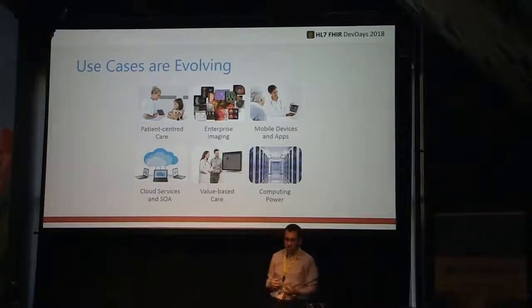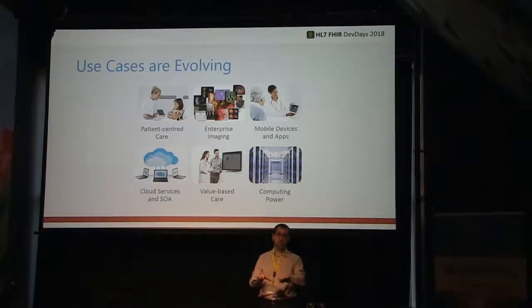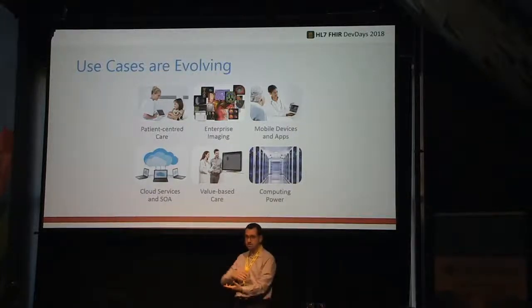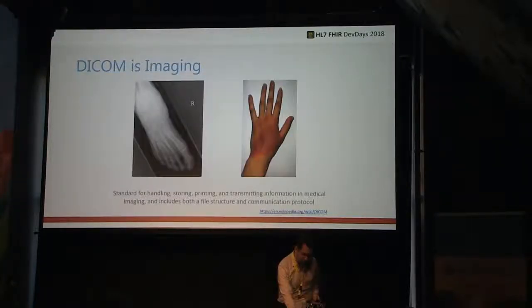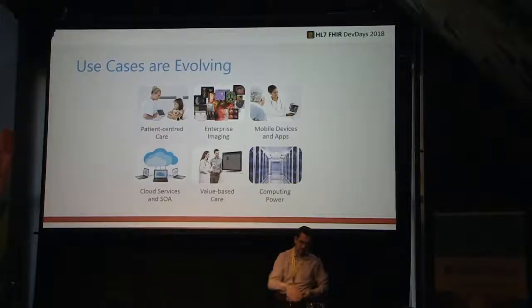The physicians are also not the same as before. They're not always just sitting at a computer and looking for images. They may be running around the hospital with tablets, looking at images, right, as they attend to patient after patient after patient. Also, computing power has tremendously increased here.